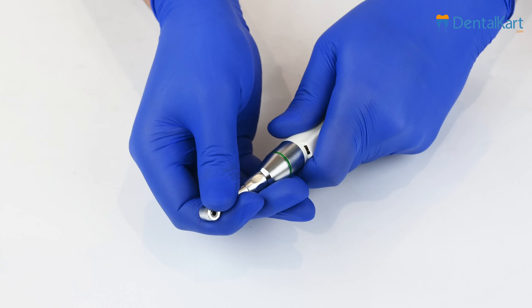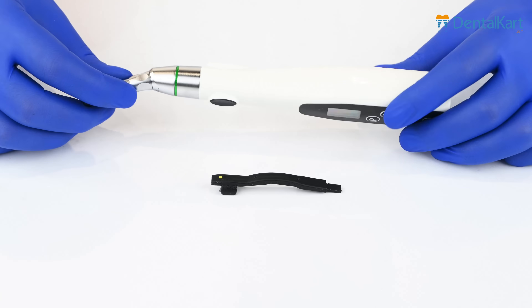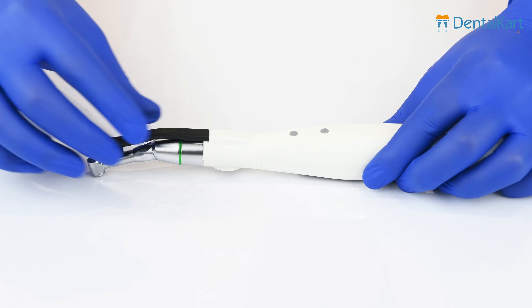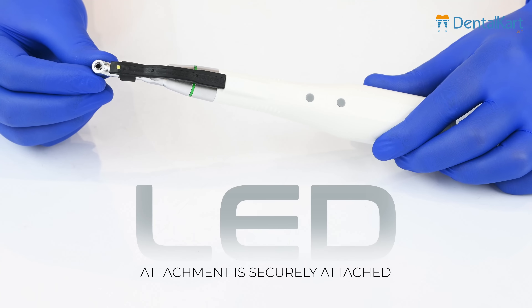If you want to change the position, simply detach the handpiece and reposition it as desired. Start by locating the LED attachment, which is typically provided as an accessory with the Endoking Cordless LED Endomotor. Identify the LED slot on the handpiece, slide the LED attachment into place ensuring that it aligns correctly. Apply gentle pressure, indicating that the LED attachment is securely attached to the handpiece.